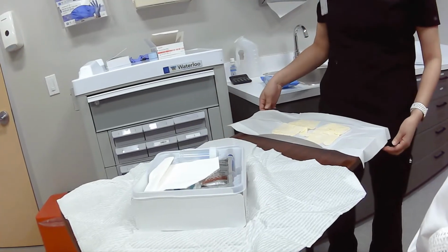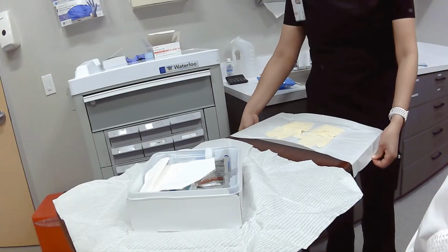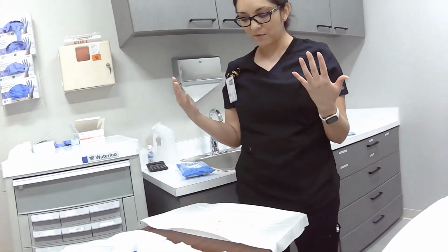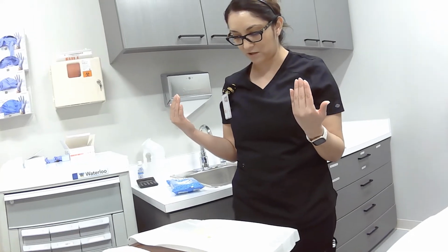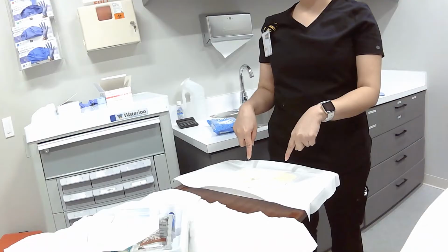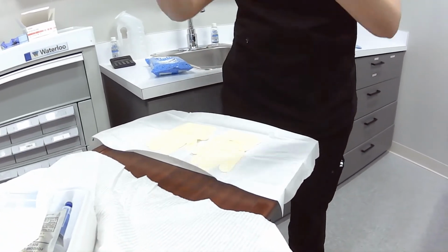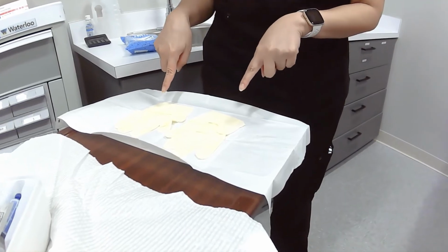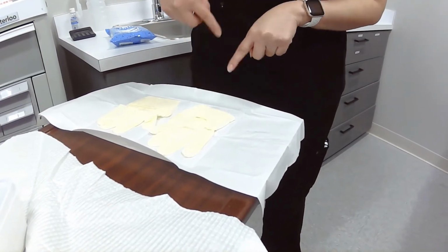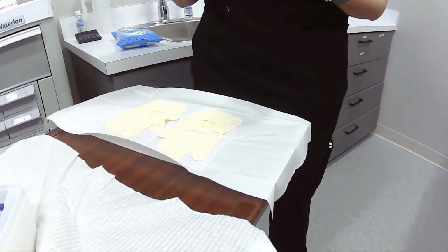Still doing okay, Miss Adams? Alright. Okay, so when you're putting on your sterile gloves, there are some rules that you want to follow. So you're going to see the cuff inside is going to be folded. It's like the inside part is folded over to the outer cuff, okay? So this is considered not sterile. All of the exterior of the glove is considered sterile.